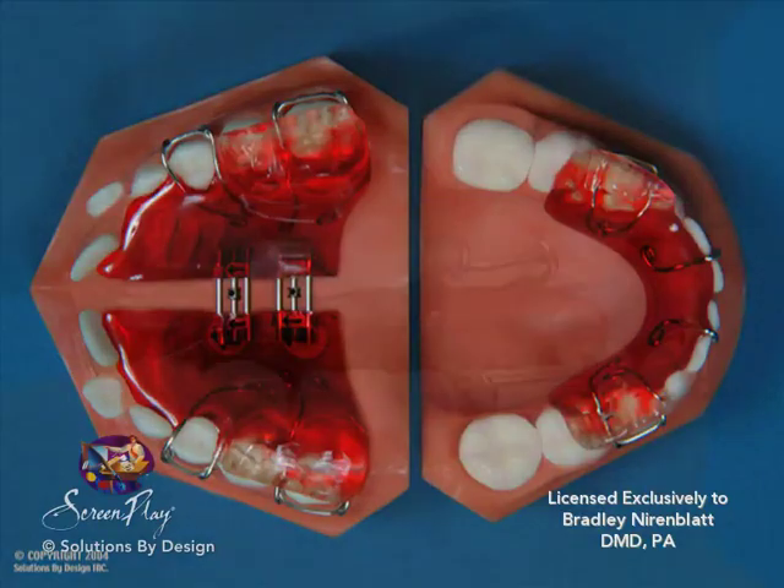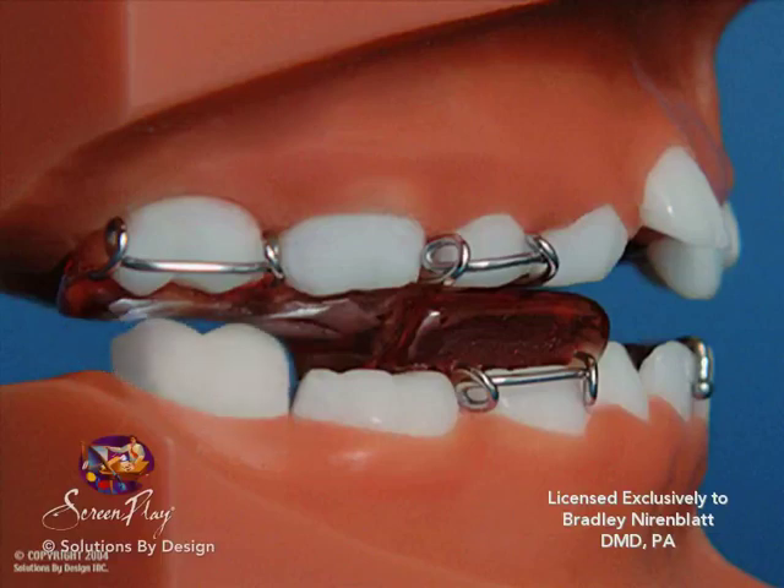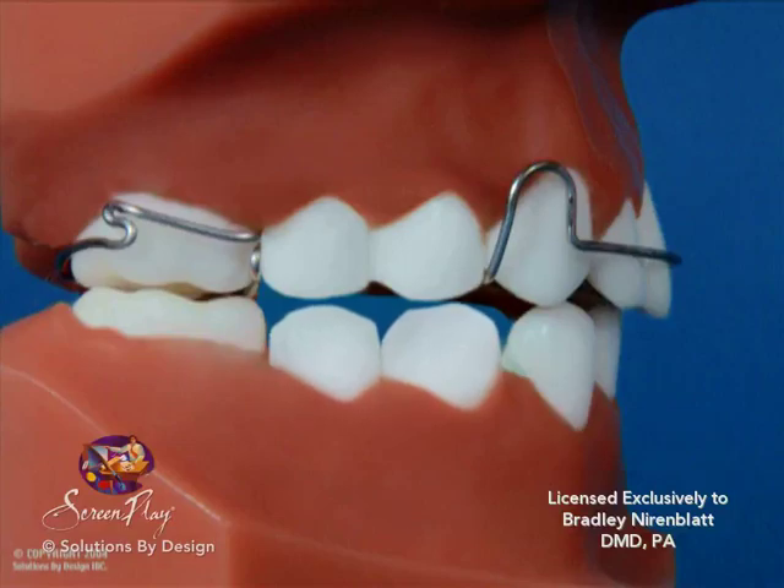Once the intended results have been achieved, the acrylic is reduced in the rear part of the upper appliance to allow the rear molars to erupt further. A final stage in utilizing this appliance is the placement of an incline plane retainer, which allows the remaining rear teeth to erupt to close the remaining space.